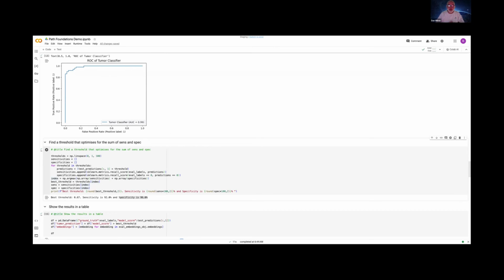My histotechs receive all of the tissue, they process it, they make slides, they scan everything, and then I sit down to my workstation and case number 1 comes up and the AI has already said, oh, this is a lung case, not because somebody told me, but because it looked at the tissue. And I've gone and pulled the lung algorithm from company X's website or cloud or wherever, and I've run it, and here's the annotation. And then the next case is colon. Oh, I've gone and called company B's.